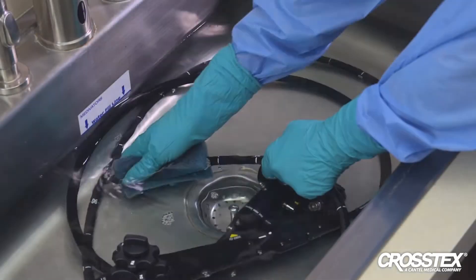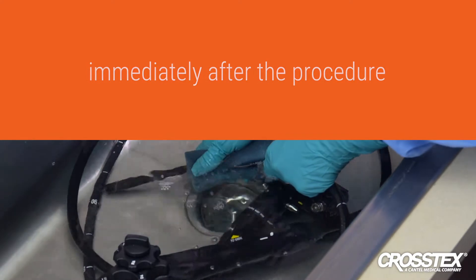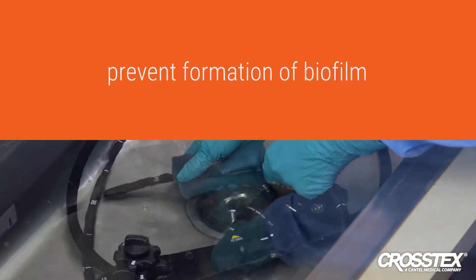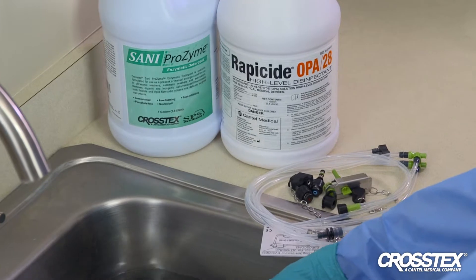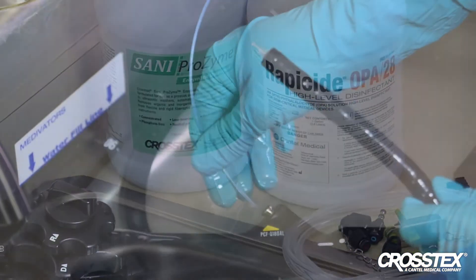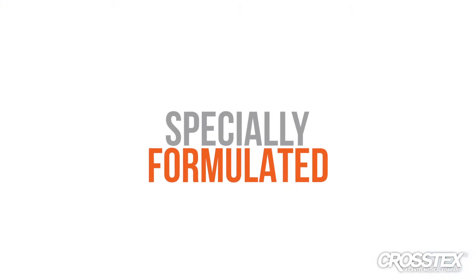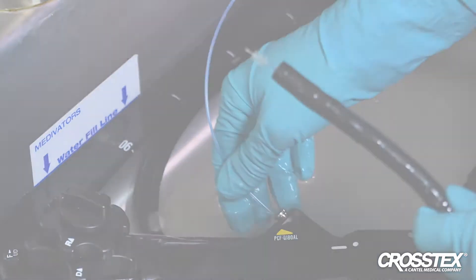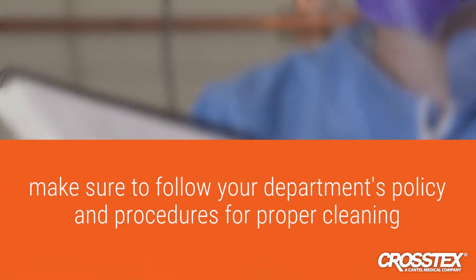Instrument cleaning and decontamination should occur immediately after the procedure and before reprocessing to prevent soil from drying and to prevent the formation of biofilm. Crosstex recommends Crosstex Sani-Prozyme enzymatic detergent for ultrasonic or manual cleaning. Enzymes and detergents like Crosstex Sani-Prozyme are specially formulated to break down or digest organic soils so the detergent can remove them without being redeposited on the cleaned instrument surface. Make sure to follow your department's policy and procedures for proper cleaning.